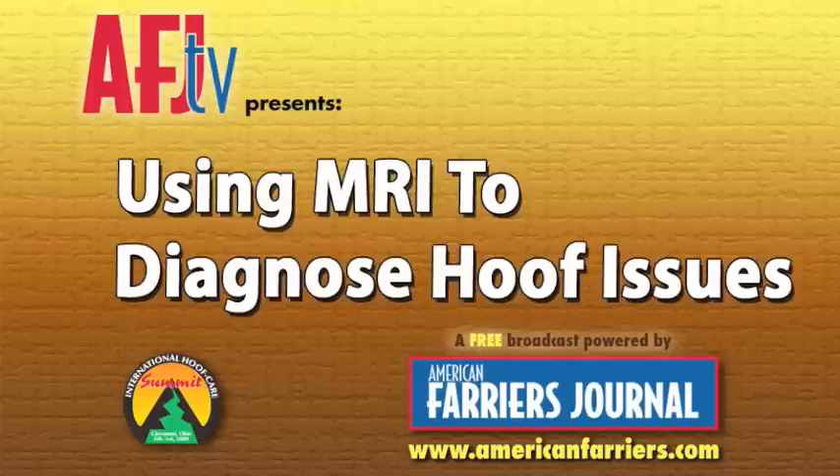Hello, welcome to AFJ-TV. In this episode, Dr. Courtney Bolan-Bretel of the Wisconsin Equine Clinic shows us how they set up for a general anesthesia MRI examination, and then shows the process for interpreting the MRI data.